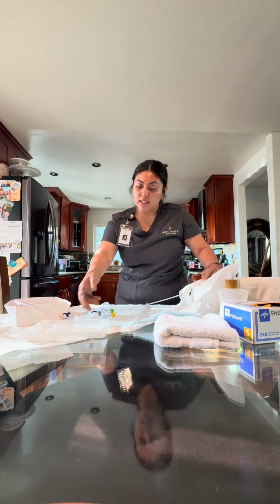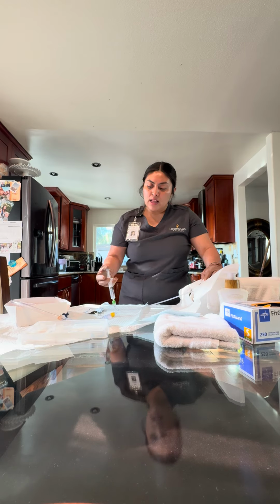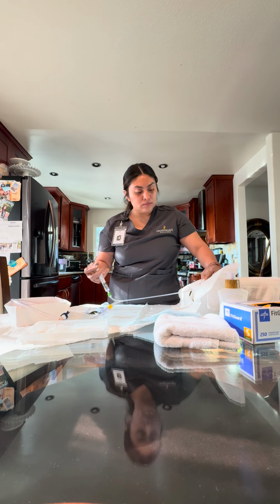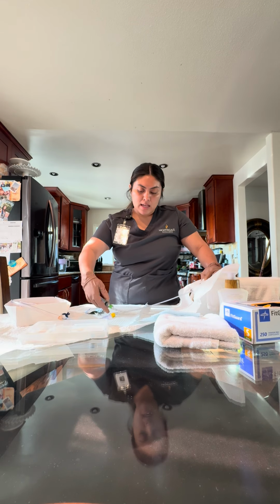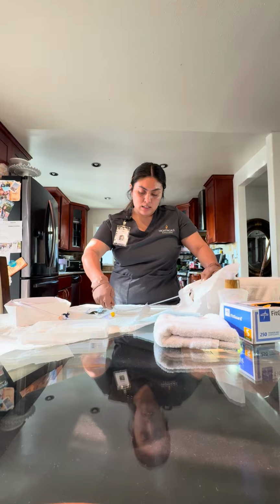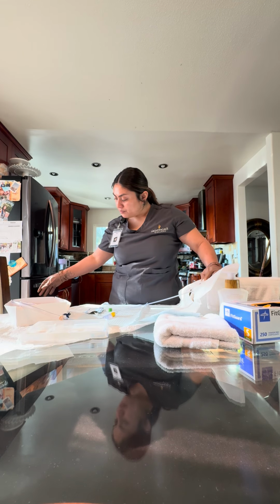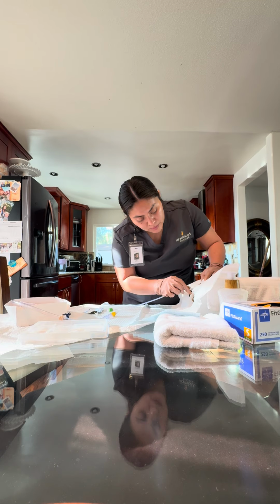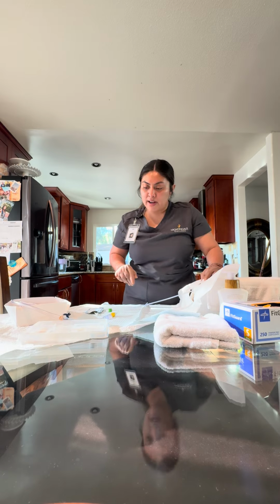After that has been placed, I'm going to fill the balloon. After that, I'm going to discard the syringe. I'm going to tug a little bit to make sure the placement is correct.